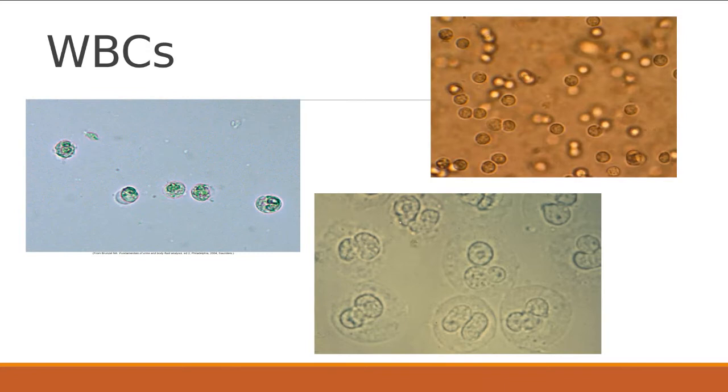So neutrophils are your most common because of infection. They are larger than the red blood cells, about 10 to 14 micrometers. 0 to 5 per high power field is also normal. So just like with your red cells, you can see a couple of them and it can still be okay. But usually, once again, you're going to take those 10 fields and average. They're similar to the size of the nucleus of squamous epithelial cells. Remember, we looked at that already.